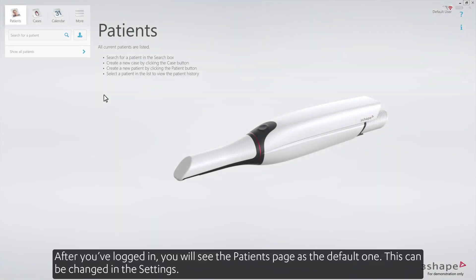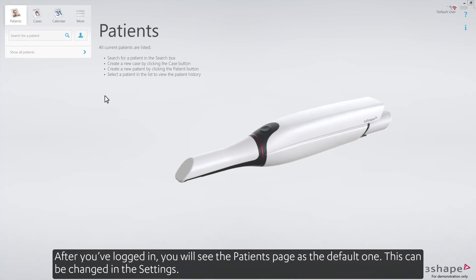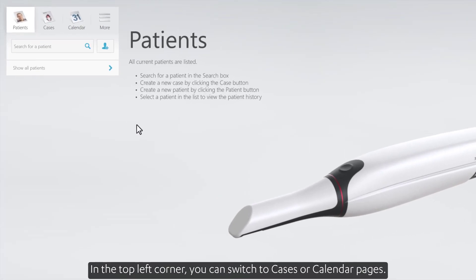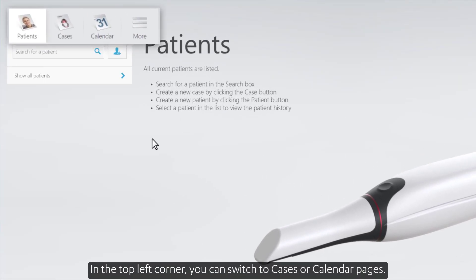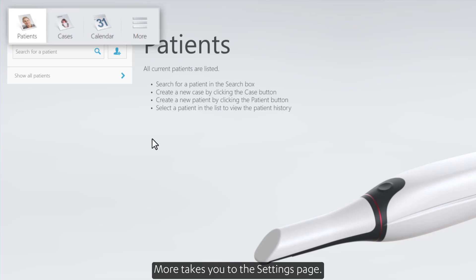After you've logged in, you'll see the patient's page as the default one. This can be changed in the settings. In the top left corner, you can switch to cases or calendar pages. More takes you to the settings page.